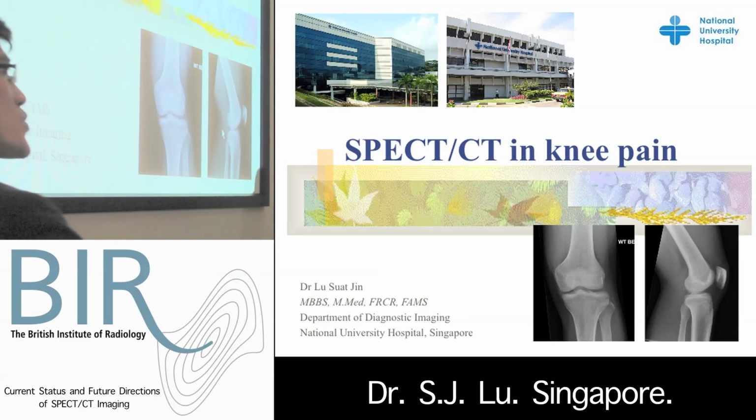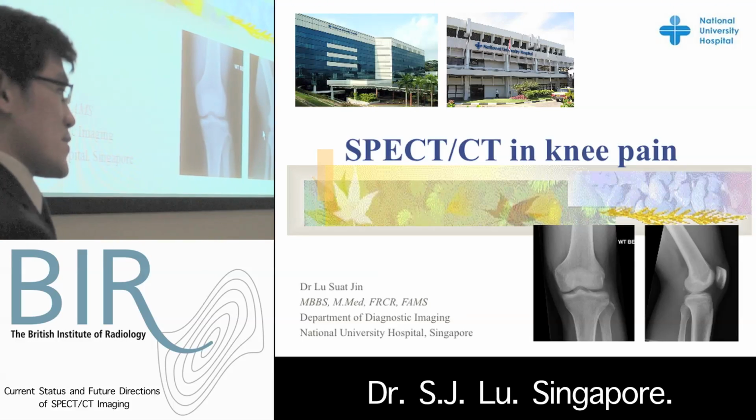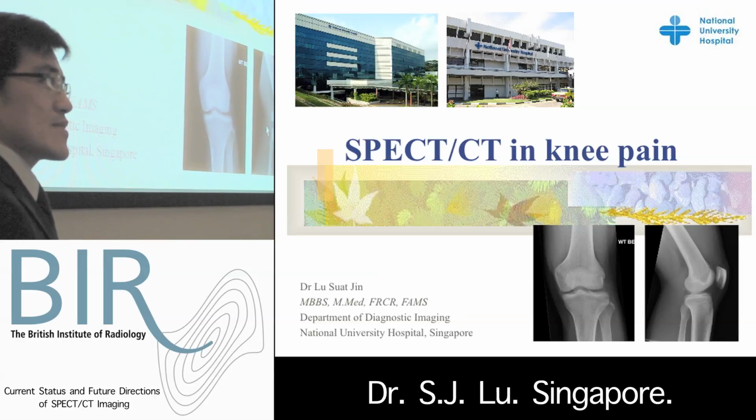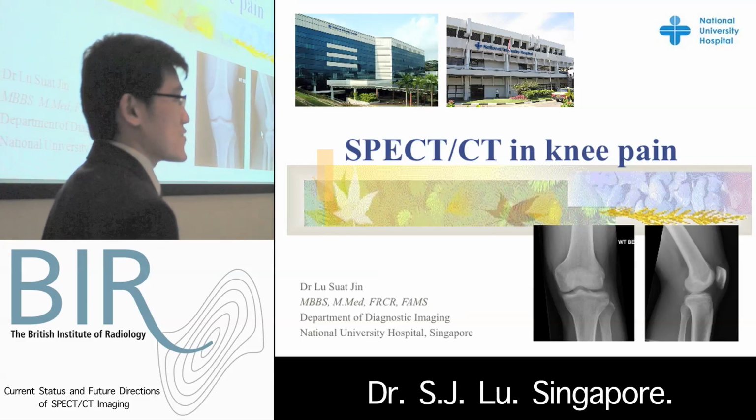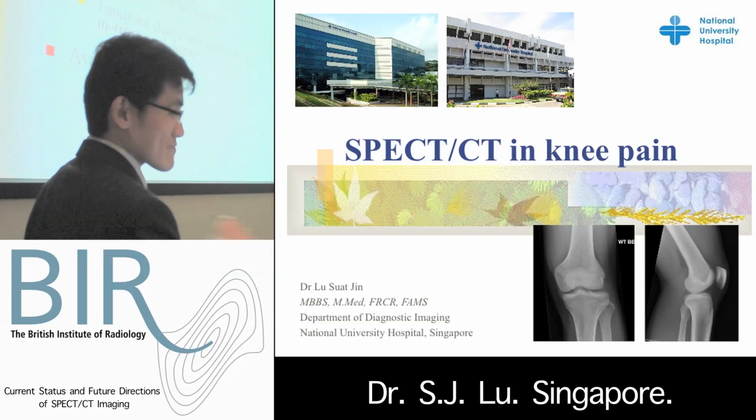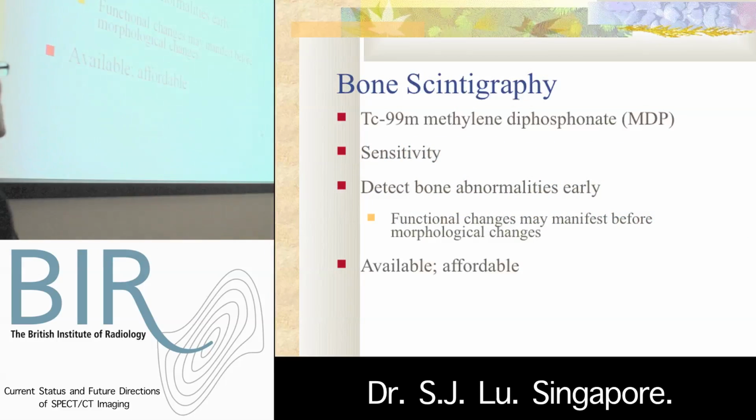I shall begin my talk with a brief overview of the strength and limitation of the bone scan, and then further proceed to highlight the incremental value that SPECT adds to bone scan. So we are all very familiar with the bone scan.